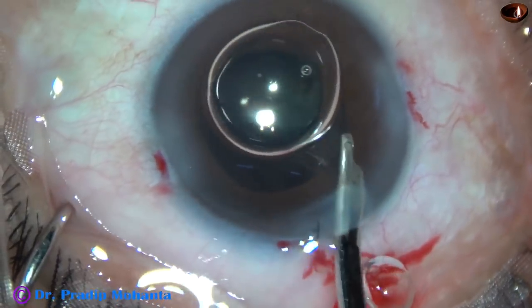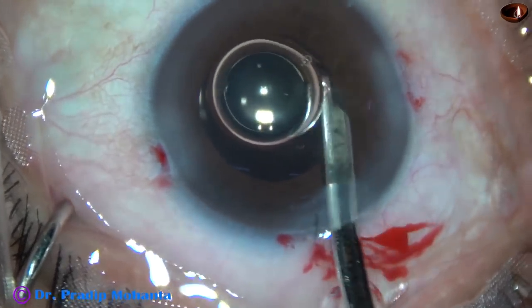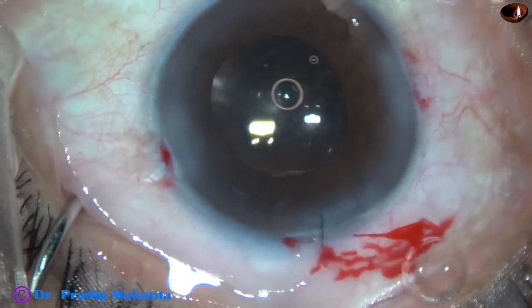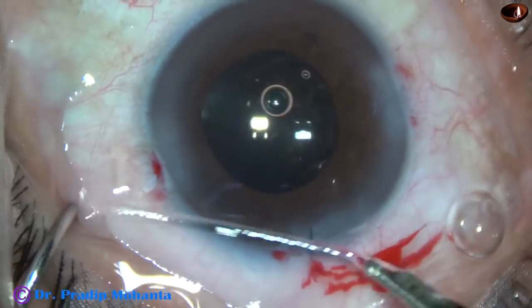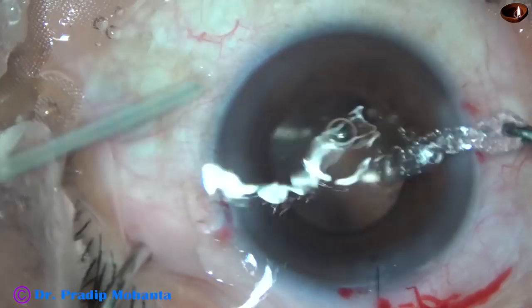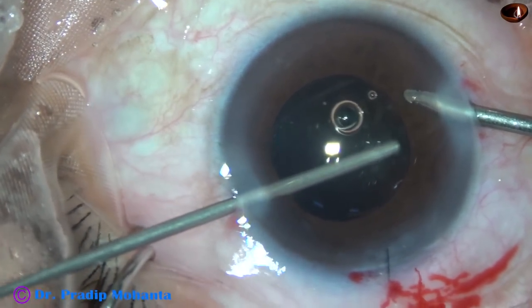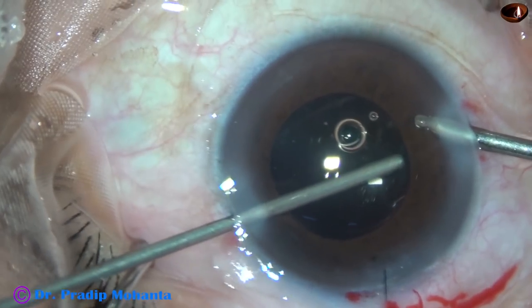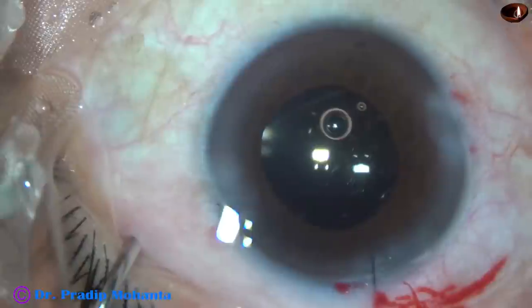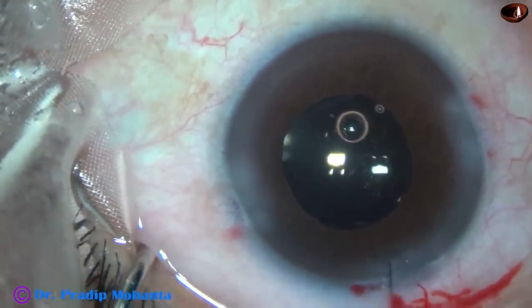And now during this final step I note something — I use the cutter again and trim the vitreous strand from 10 o'clock. This is moxifloxacin.